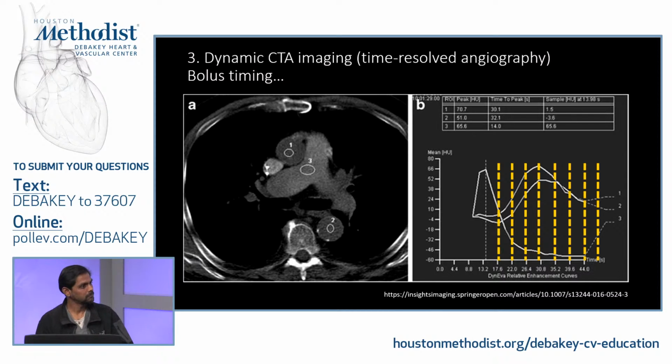Generally speaking, the dynamic CT scans that we're doing do not have an increased amount of radiation exposure. I would say they are equivalent to a typical aortic arterial and delayed phase imaging. That is typically done at 100, 120 kV, because when you are doing these routine protocols, we often tend to go higher on the kV side to make sure that across different patient habitus the image quality doesn't suffer. Whereas here we try to lower our kV, and at least in our experience, we could acquire a dynamic scan, whether it is for endoleak or aortic dissection, at almost equivalent dose as a triphasic or a non-contrast, arterial and delayed imaging.